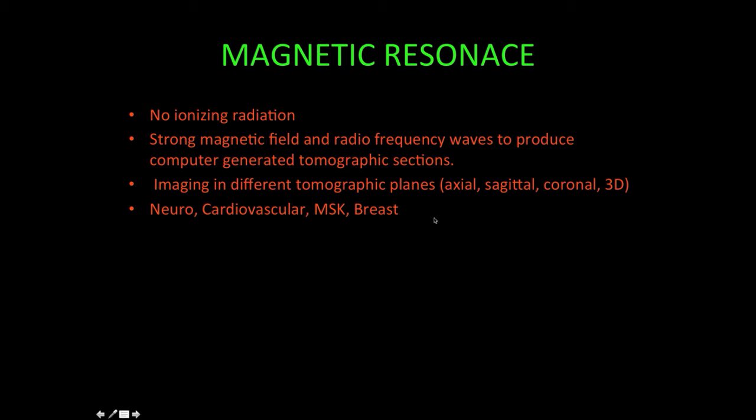It doesn't have the detail that a CT of the chest does. So remember also, if the patient has had surgery or has surgically implanted devices, surgical clips, there is limitation. Some of these are not friendly with MR. So there is some limitation, and you have to be cautious with that.